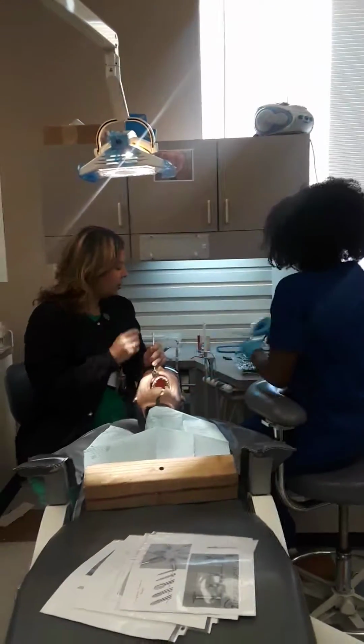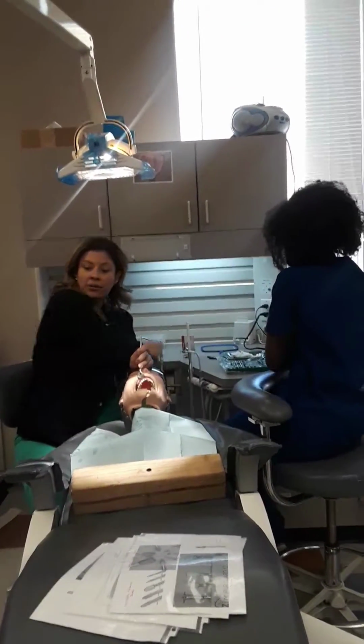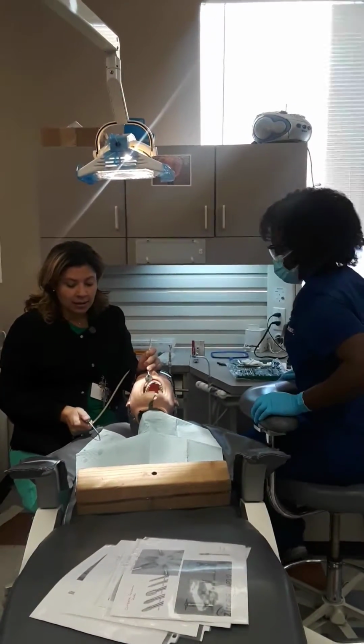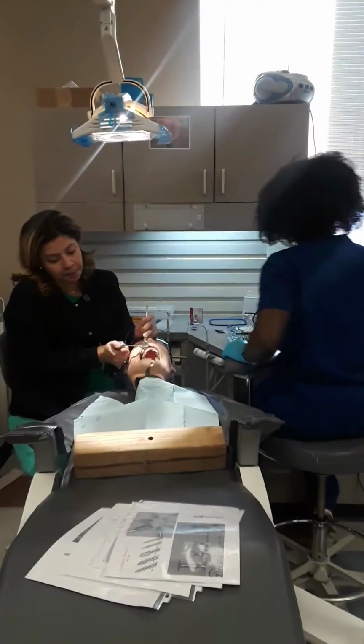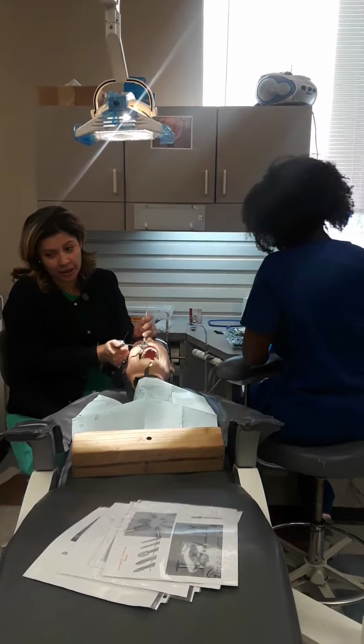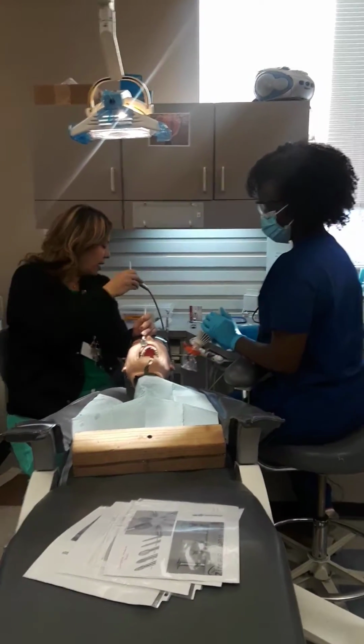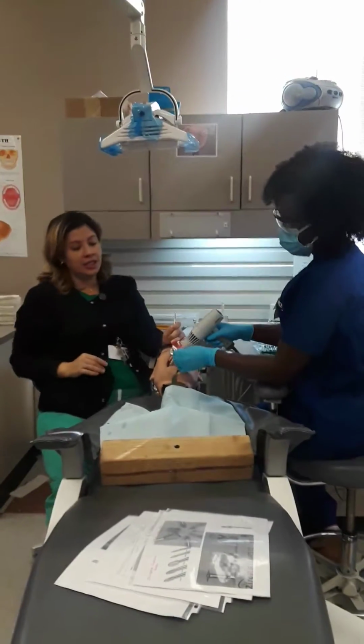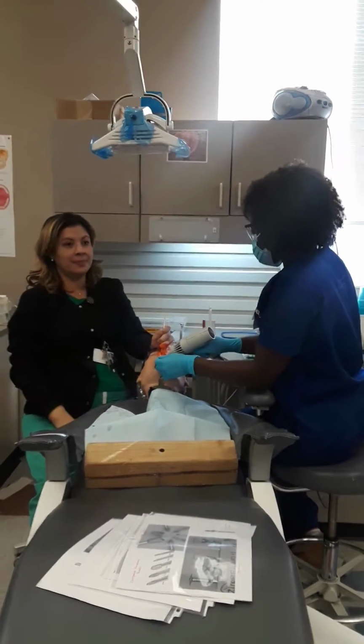So you're going to see me dab it a few times, take it to the tooth. Add a side note: an assistant or doctor will always do a burst of air on the tooth to make the bond thinner. So we're going to burst some air to make it thinner. And then she's going to cure for 20 seconds.